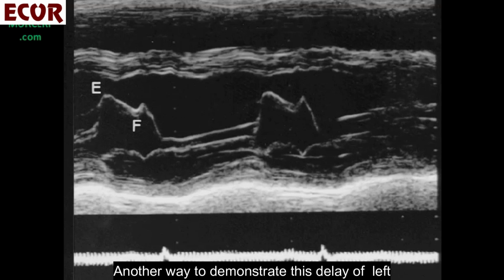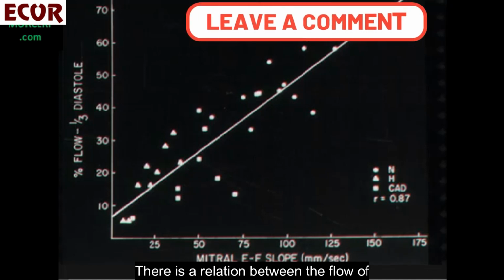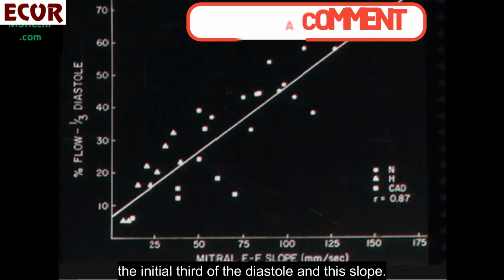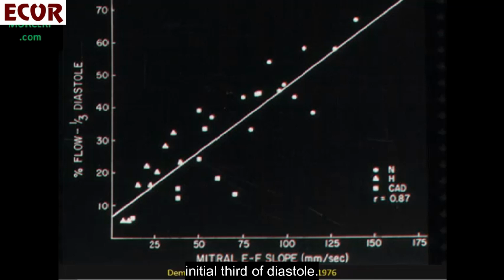Another way to demonstrate this delay of left ventricular filling by M-mode is observing the mitral valve. The EF slope delay is very simple to notice and very specific, as long as there is no mitral valve pathology. There is a relation between the flow of blood that occurs through the valve during the initial third of diastole and this slope. The greater this velocity, the more the percentage of flow is happening during the initial third of diastole.